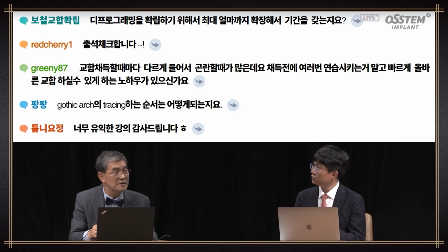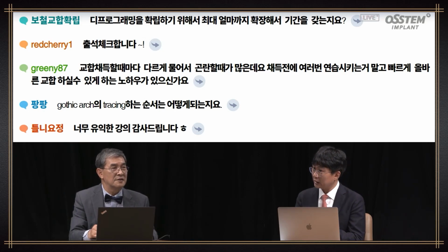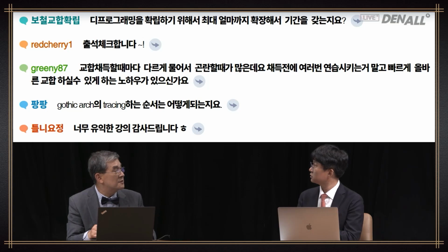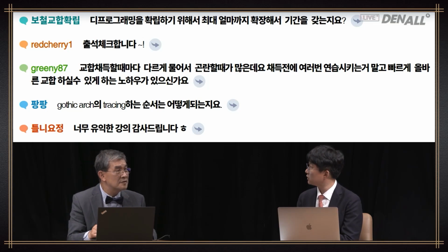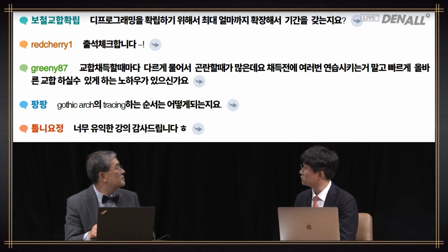The deprogramming can work on the chewing muscle pretty fast, but if the denture was used for more than 10 years or TMJ was changed, it is not easy to erase the habit on the day. With the treatment denture, you take time to go through the changes. As I said before, it can be used from 1 week to about 1 month and no more than 3 months. Okay, understood?